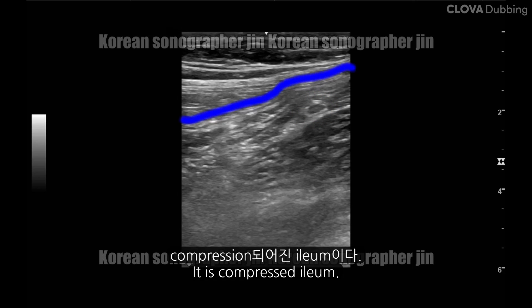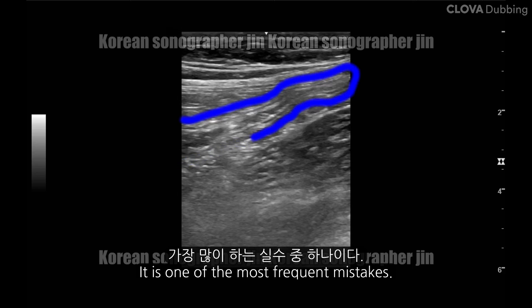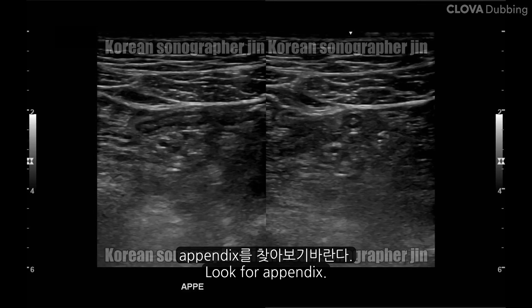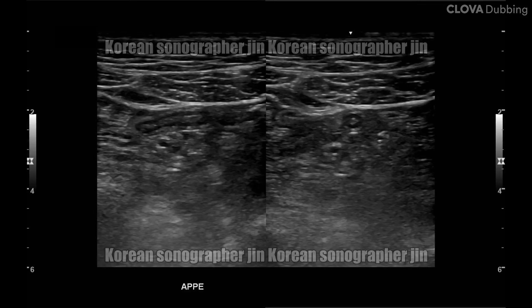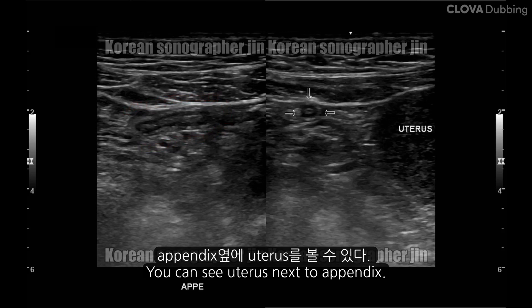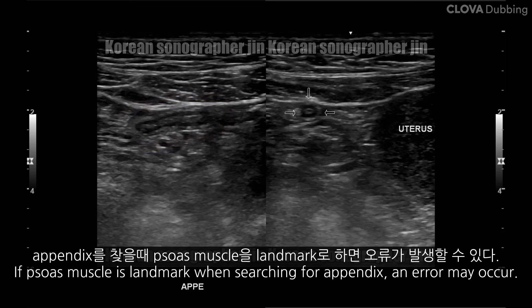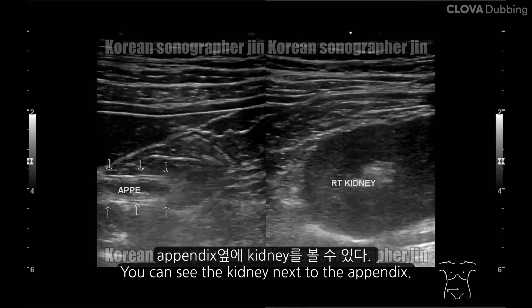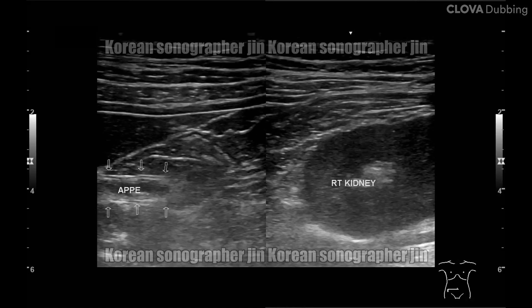The appendix is visible here. The appendix.